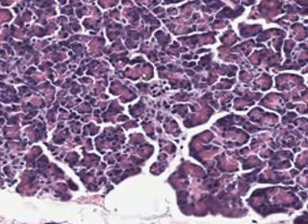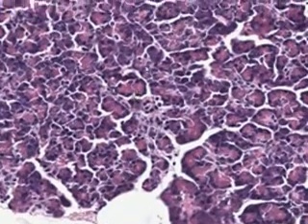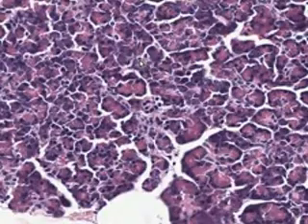These granules in the cytoplasm, like here, and all throughout here, and perhaps the majority of this cross-section are zymogen granules secreted by acinar cells. Sometimes you have cells which look like fried eggs, like here, here, here, and they have no granules. These are centroacinar cells, and they are the very beginning of the duct system.